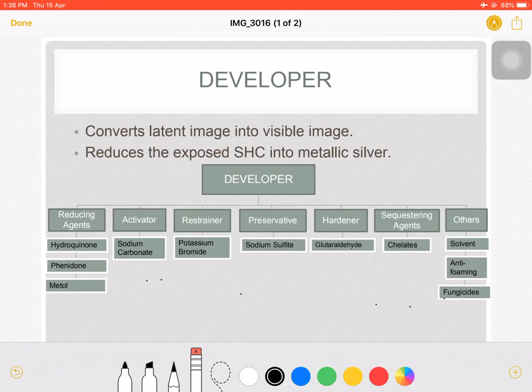Next to our preservative is the hardener, or yung tinatawag na tanning agents. Okay? So, ang hardener ay nakikita lang sa components ng chemicals na ginagamit for automatic processor. So, this is added to developer solution to prevent swelling of emulsion, para makontrol niya yung too much swelling of the emulsion, so that it could reduce film transportation problems and will prevent damage to the emulsion. So, yung hardener sa ating developer is just a weak or temporary hardener. Hindi pa niya totally naka-harden ang ating emulsion. It just help to prevent na ma-chip off or matanggal yung emulsion by our rollers.